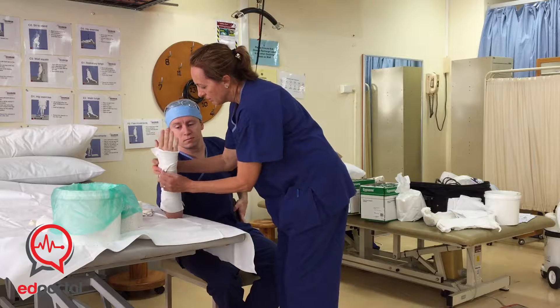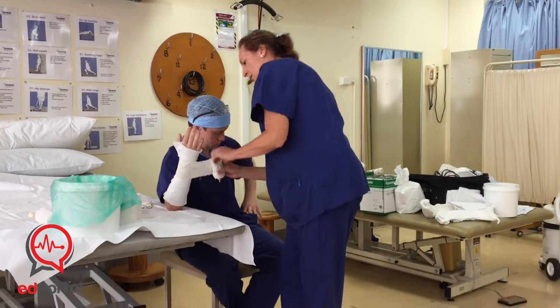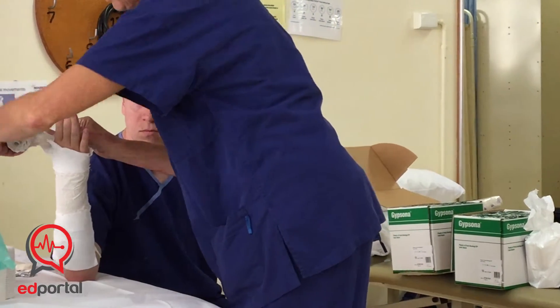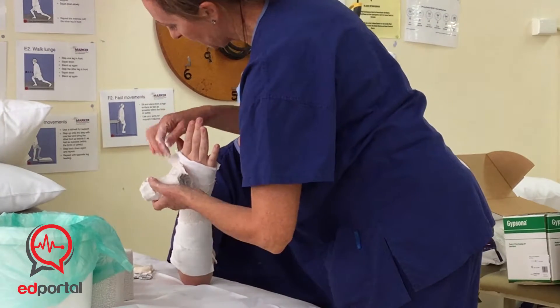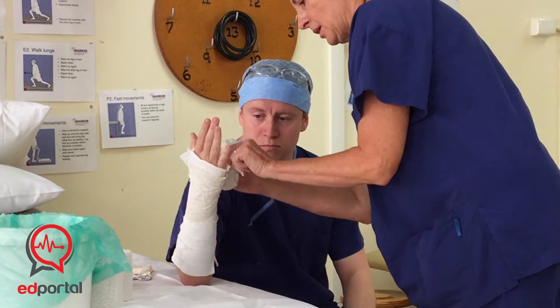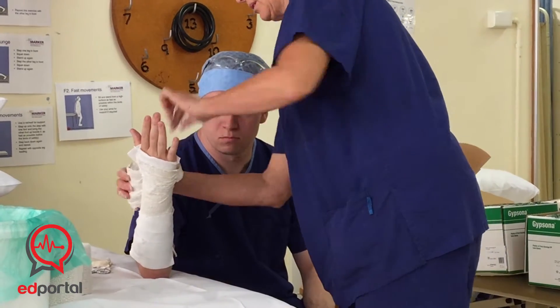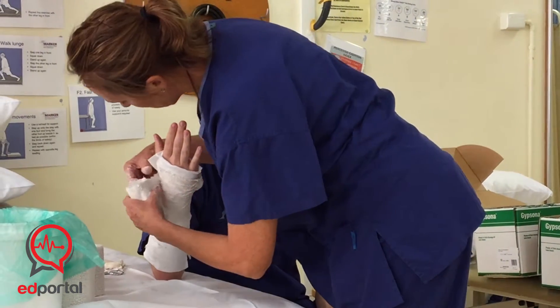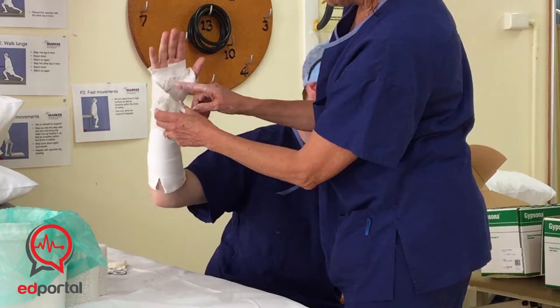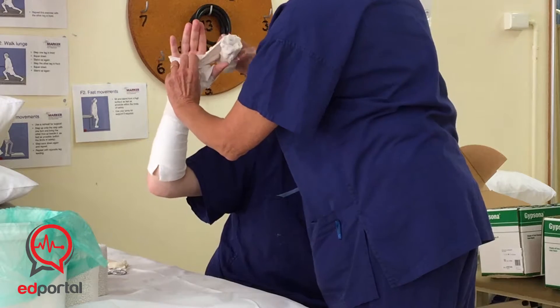Start at the wrist, wrapping it around twice, then just coming up through the web space. You can twist or squeeze it in. Keep it nice and narrow through there. Plaster is pretty user-friendly — you can just drape it and smooth it out later. I'm just draping it up, filling in the gaps. Now I'm just going to go back through there again.